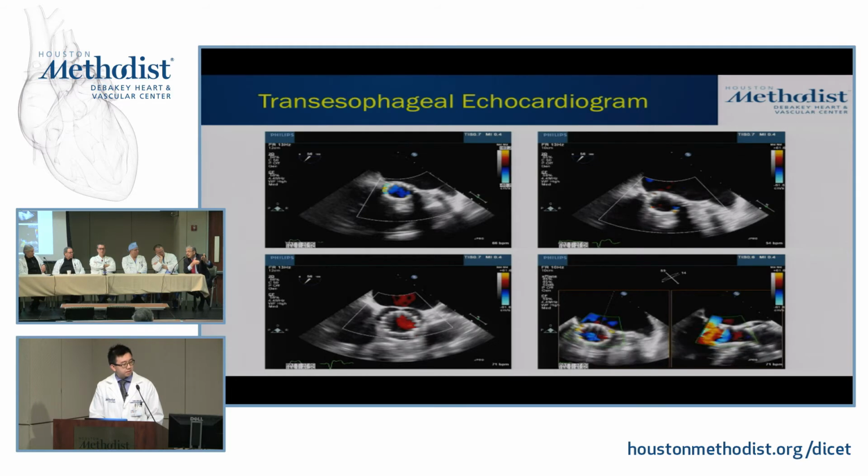Otherwise, you're either going to miss it, or two, you may overestimate it, because most of these are paravalvular eccentric jets, so it is very difficult by color. Yes, you'll detect it, provided that you do the right thing, but you want to also make sure that you're getting it at the site of where the regurgitation is. So this is the issue with imaging with echocardiography using color Doppler. And it is an issue. It is a big issue.